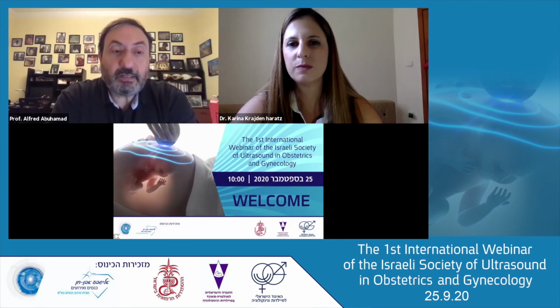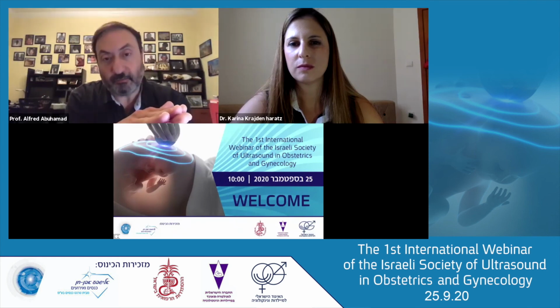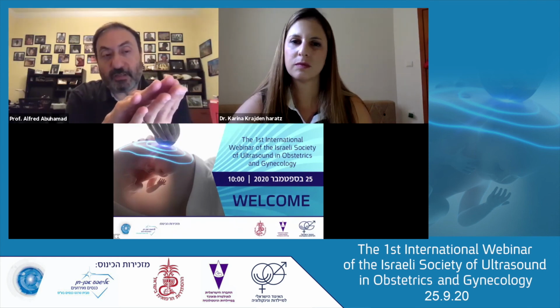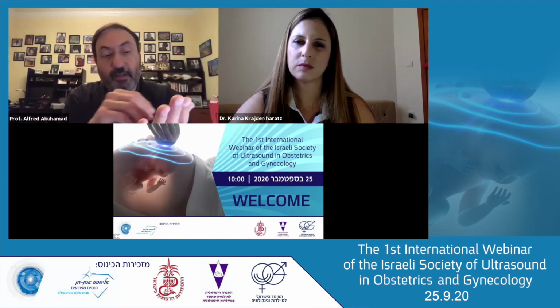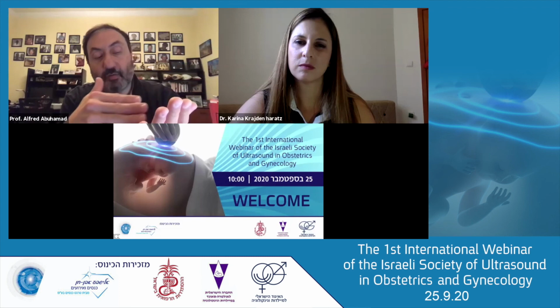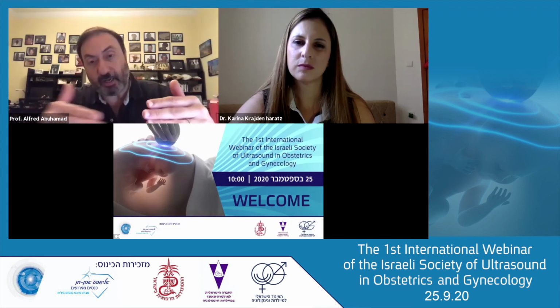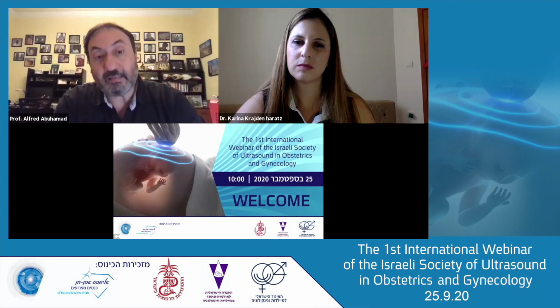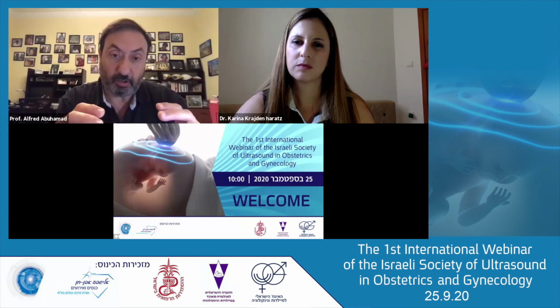So the coronary sinus is best viewed in a plane that is slightly inferior to the 4-chamber view. So from the 4-chamber view, slide a little bit lower, you will see the coronary sinus, and it looks like a line that is running across the AV valves, a little into the atria across the AV valves. When it is dilated, this line appears to be enlarged, and that's the best way to look for it.